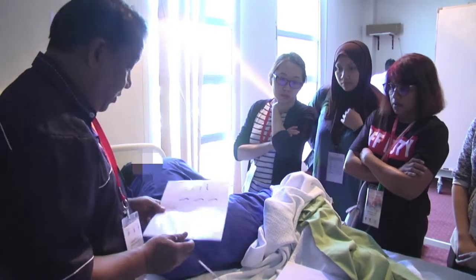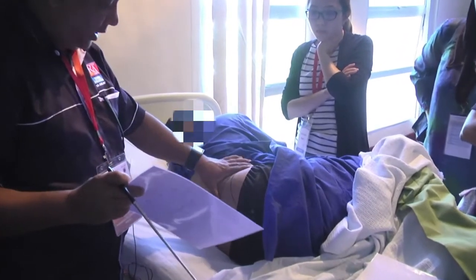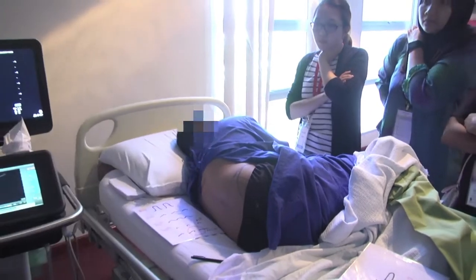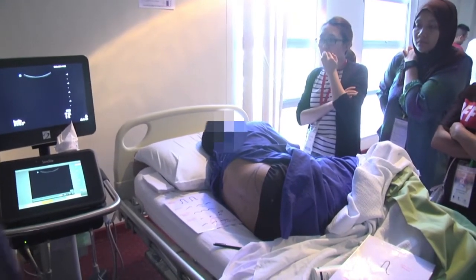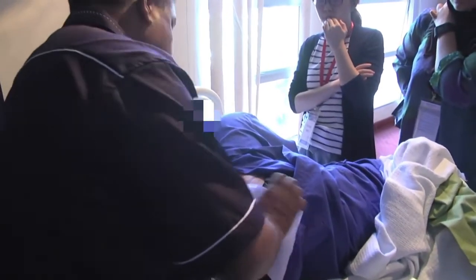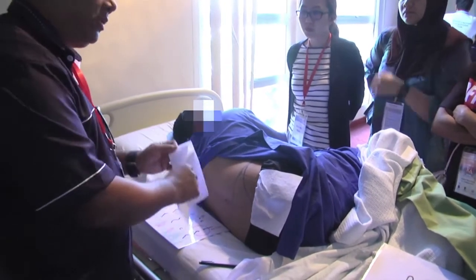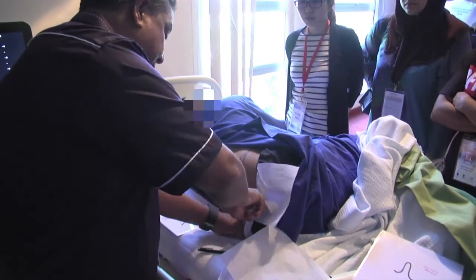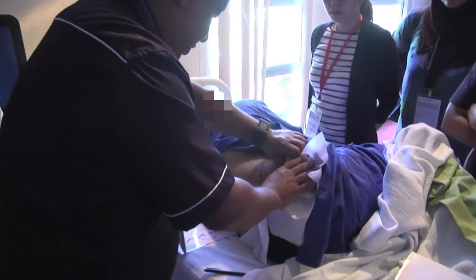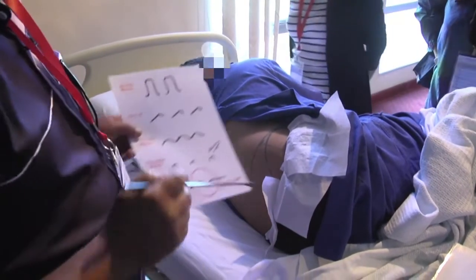Finally, when we do neuraxial blocks, we often use the intercristal line, right, to determine what level you're performing the intervention. But realistically, the intercristal line is only accurate in about 40% of individuals. So we really need to know how to determine the intervertebral level that you perform the scan. And you can see here's a good example because there's very poor correlation between the intercristal line in this individual and the level that we are scanning.